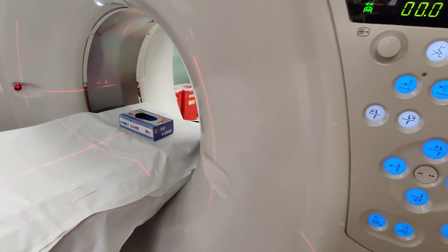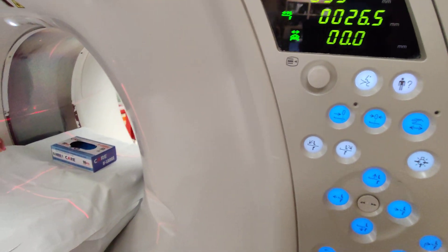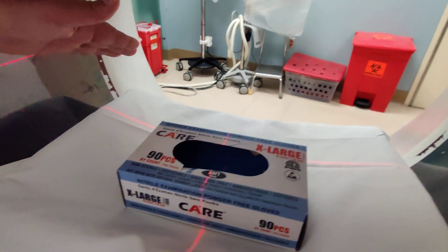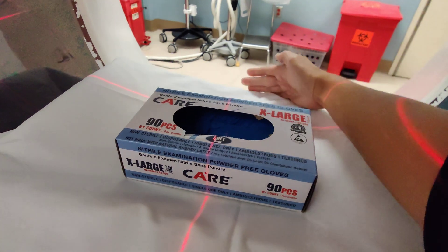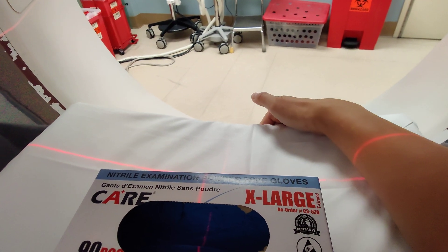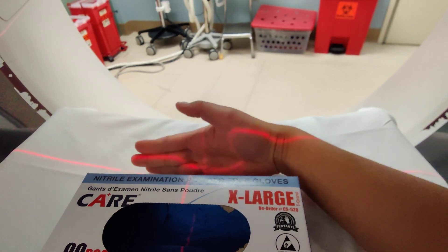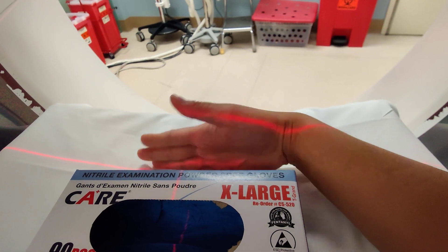This is something different. That's the one — unless you got it once and I was in trauma. Also, you don't want the feet hanging over the edge, because the scan doesn't scan back there, out of the table. So make sure the toes are not at the edge — on the table.